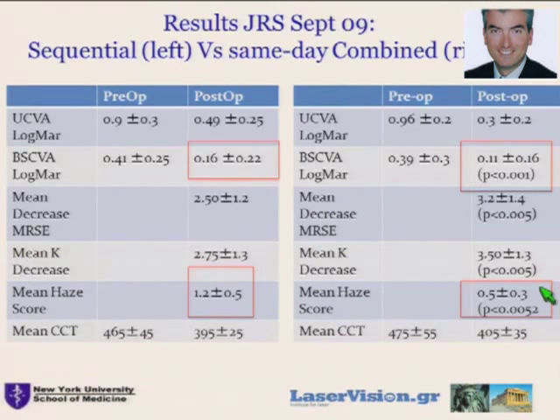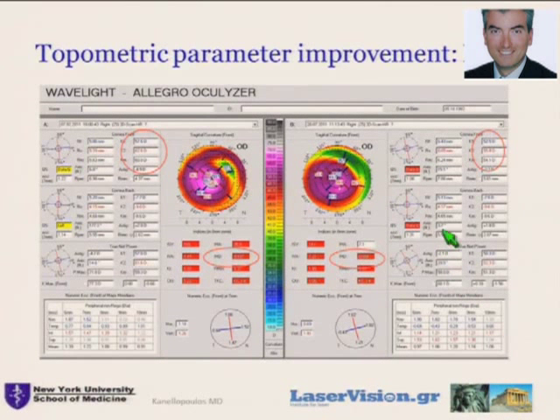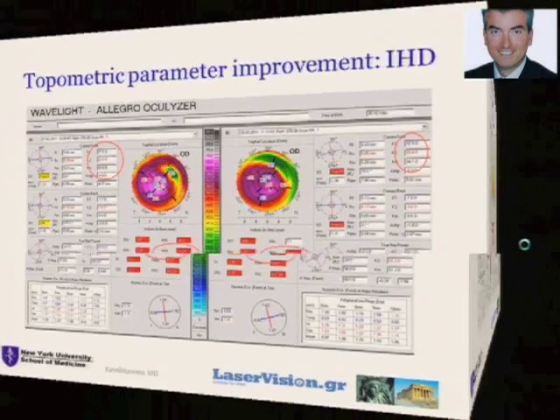Pain and visual rehabilitation. When we compared cross-linking first and 6 months later this intervention to doing them combined, we found that there's a significant synergistic effect. And here you can see a very advanced cone. Very hard to believe that 10 years ago I would even consider it an alternative to cornea transplantation for this patient, that is somehow normalized and is able to function with 20/40 vision after this procedure with a soft contact lens.